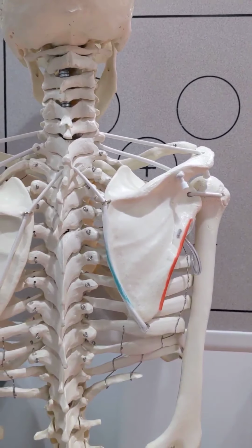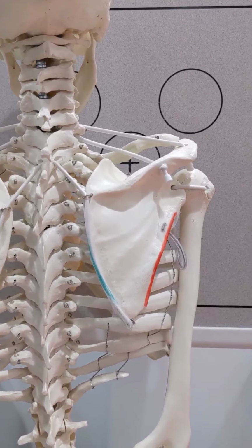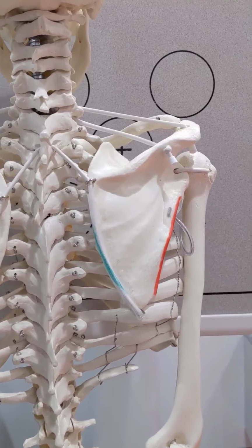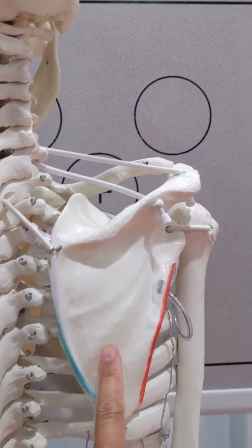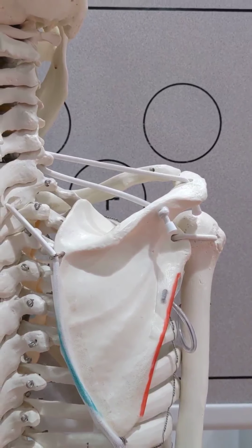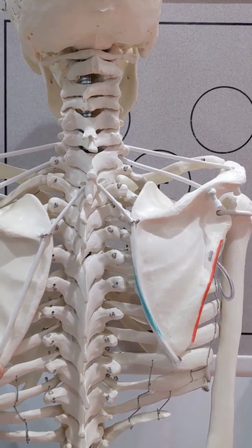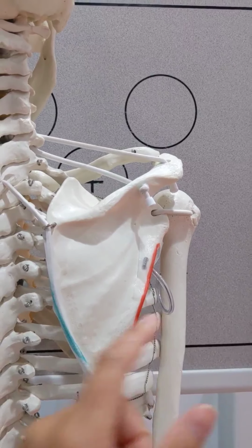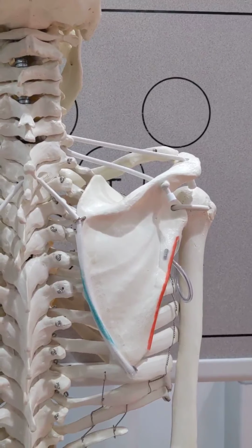So when we position the patient, we're turning them so that we can see the profile of the scapula or the side of the scapula. So what we need to do to see the side of the scapula is we're going to turn the patient so that the two sides, the medial and the lateral borders of the scapula, are superimposed.